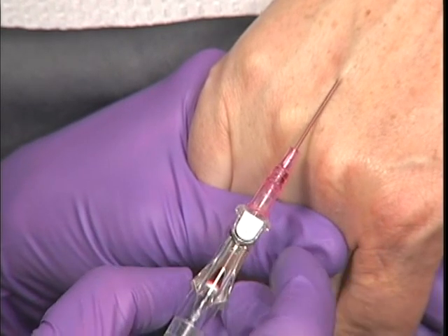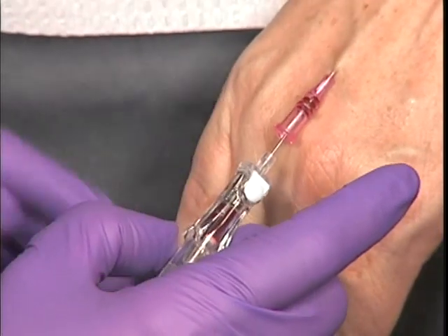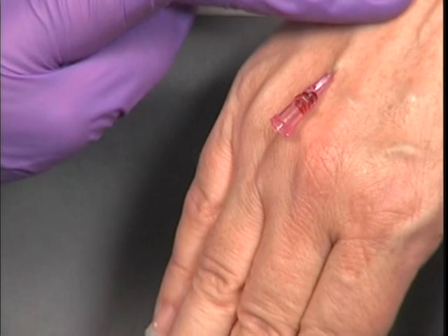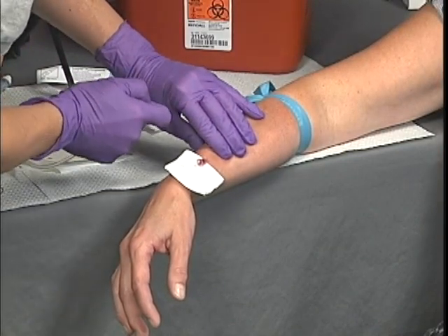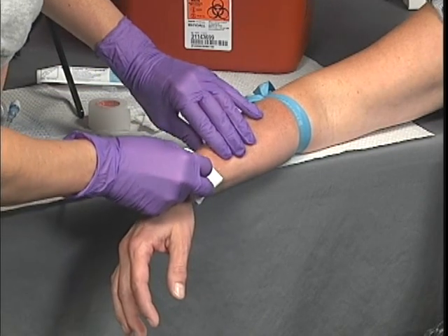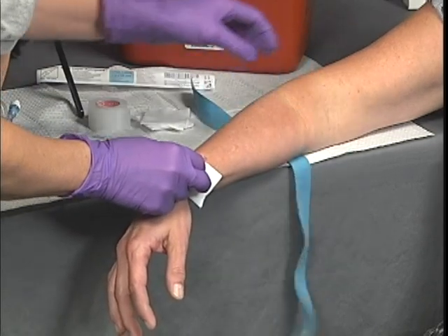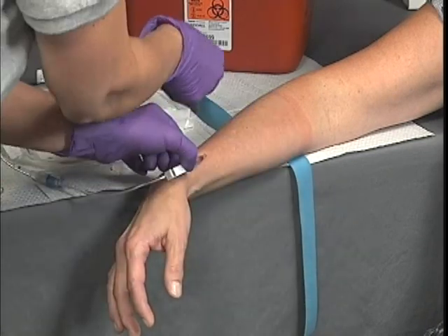Slowly advance the catheter along the needle until the hub meets the patient's skin. Palpate the end of the catheter beneath the patient's skin and occlude the vein with direct pressure. Attach the IV tubing to the catheter hub, making sure not to push the catheter further in or pull it out.